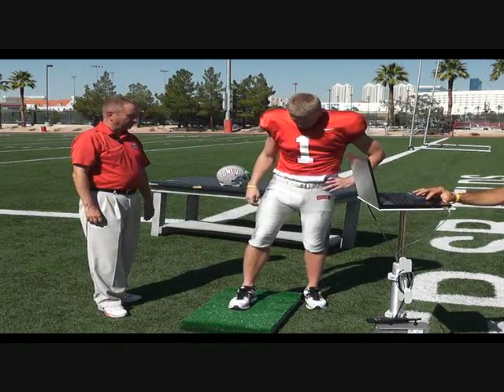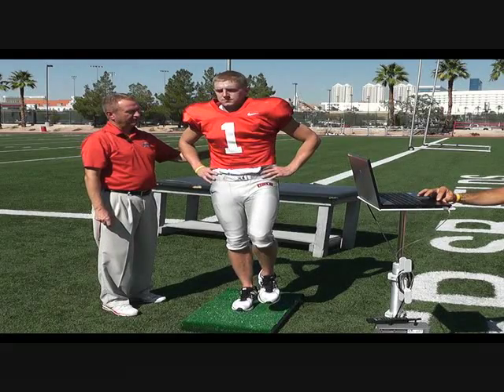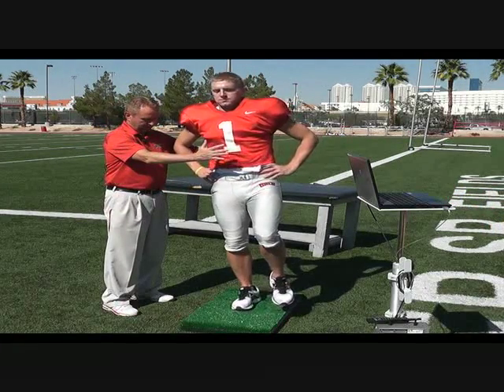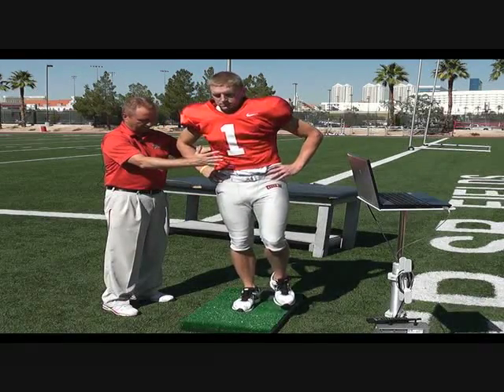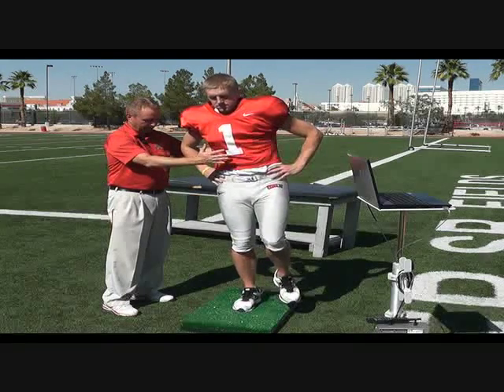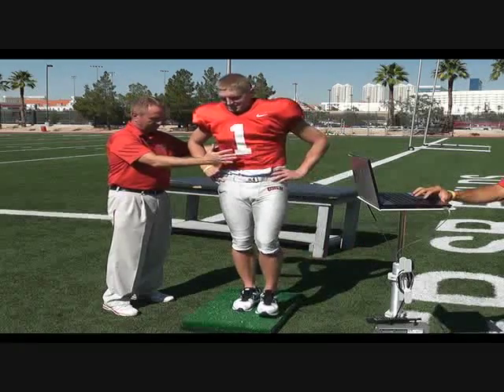Now we're going to stand on one foot. Have your right foot planted — your left foot will be up in the air. Get a good base and your hands will be on your hips. Your eyes will be closed, just for 20 seconds. Ready, begin. The computer is counting, recording any movement, any sway an athlete would have. We're here to catch them if they might fall on the sideline. Time.